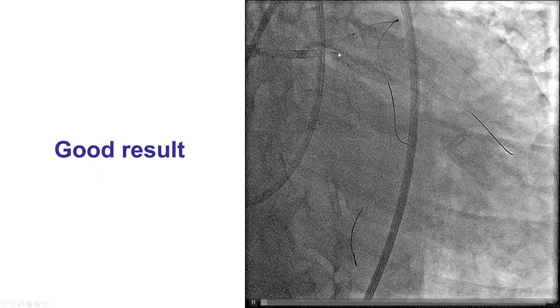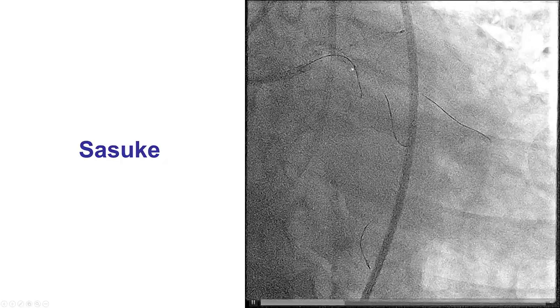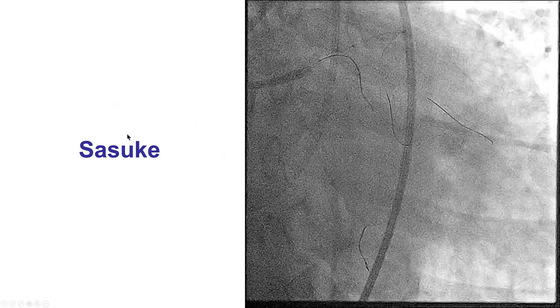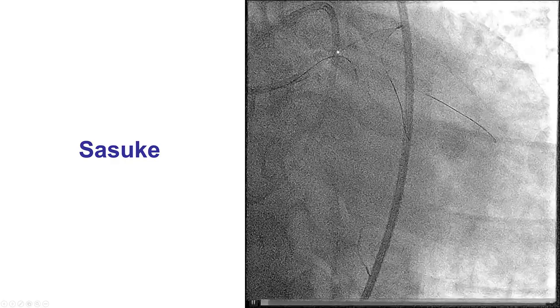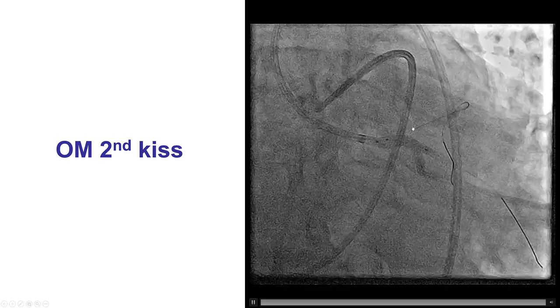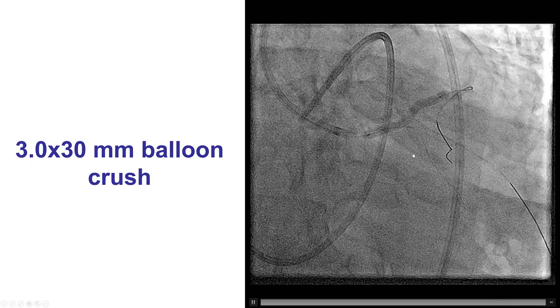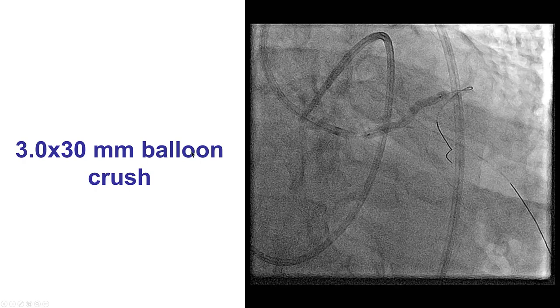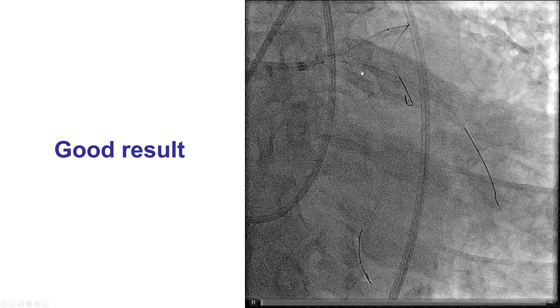The stent was deployed and good distal flow was confirmed. Before crushing the stent, we used a Sasuke dual-lumen microcatheter to rewire into the obtuse marginal branch — a critical step, as otherwise the stent in the left main was not well-opposed and there was significant likelihood of the guide wire going behind the stent struts. After doing that, we performed the second kissing balloon inflation into the circumflex–OM bifurcation, confirmed a nice result, and then crushed the circumflex stent by placing a balloon from the left main into the LAD.